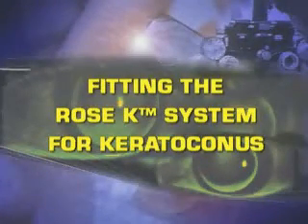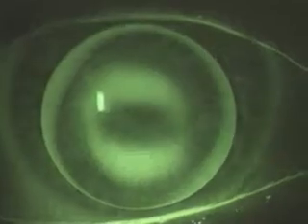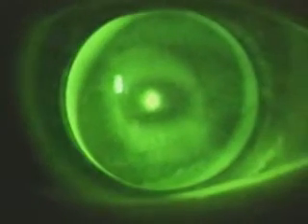For many practitioners, fitting a patient with keratoconus is a time-consuming and frustrating undertaking. Irregular corneal topography, a wide range of severity, and a variable rate of progression present the practitioner with unique fitting requirements in each case. A poorly fitting lens can cause considerable damage to the cornea and may result in significant scarring and loss of visual acuity.